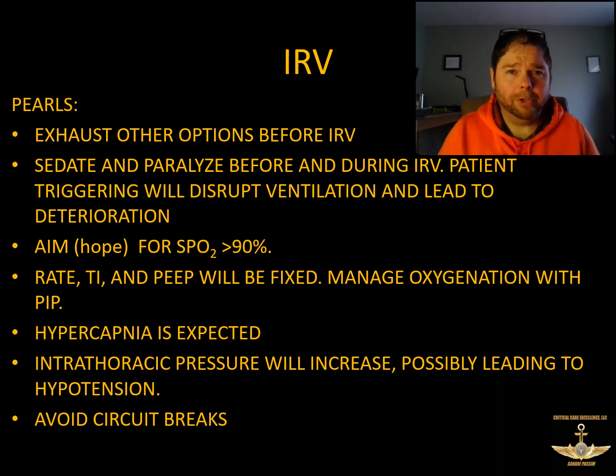And you really want to do that before you leave the referring facility if you can help it, while you're sitting still and you've got a second and you can really take time to find out what that number needs to be to get your oxygenation where you want it, or the best you can get it. Because your rate especially and your expiratory time are going to be fixed, some degree of hypercapnia is to be expected with this mode.